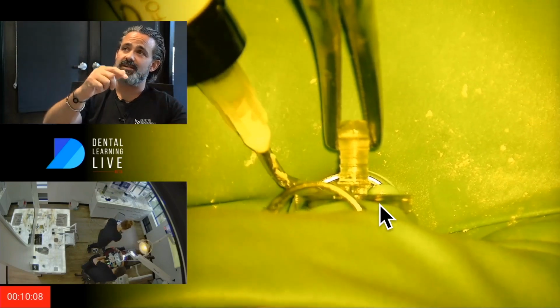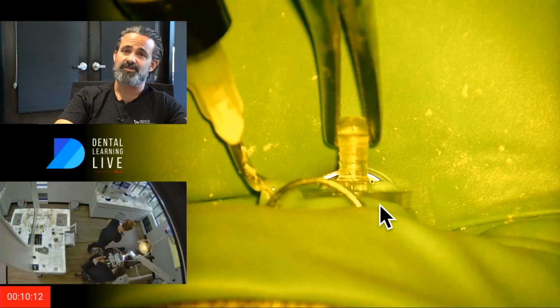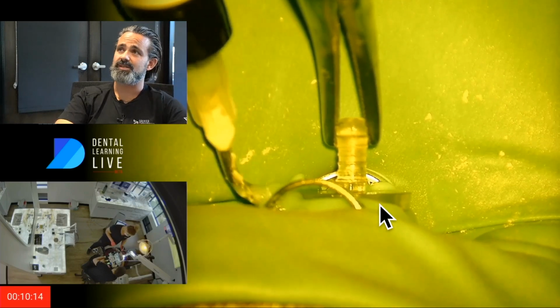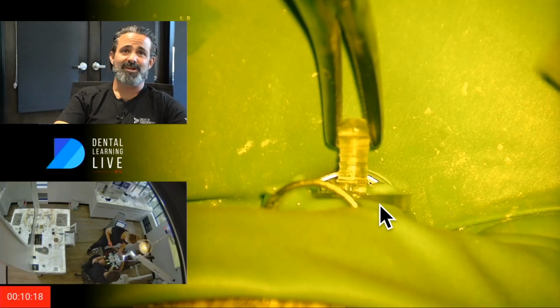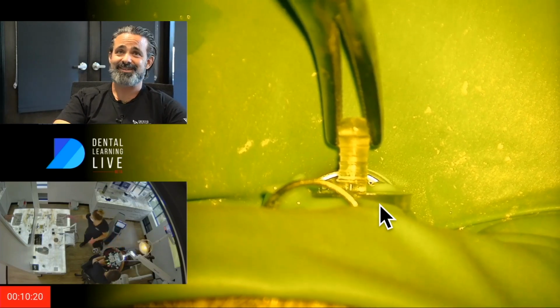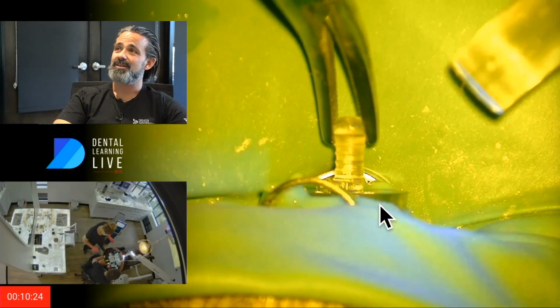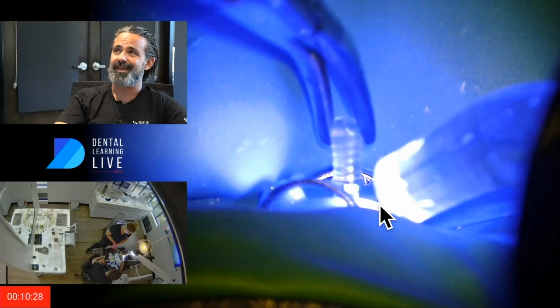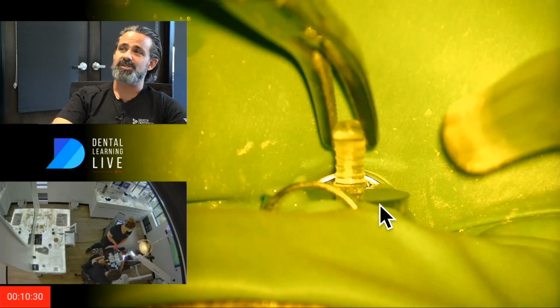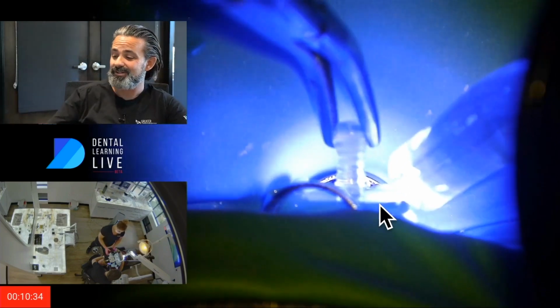I switched my hands and I'm coming up under the other way. And so left-handed, I'm just doing it under the palatal side, and again, injecting it up. And realize mud pies are where it's at. Just make the mud pie, and you get a great platform out of it. So that's all I've done, and I'm going to do a quick cure. Now, I know I can always come back and add if human error occurs here, because it's really easy to patch.